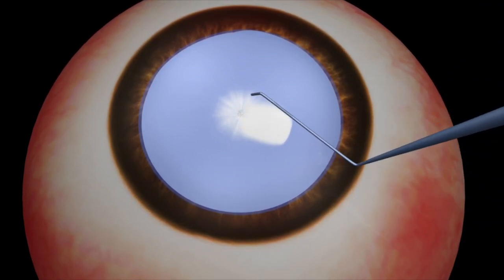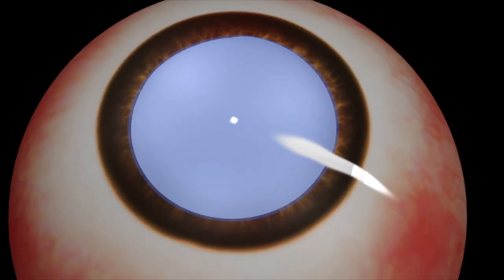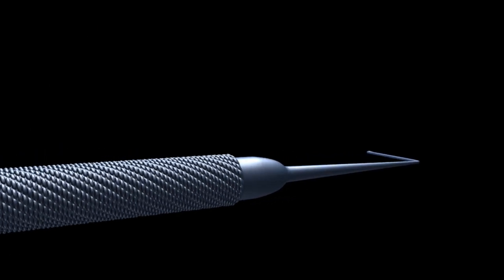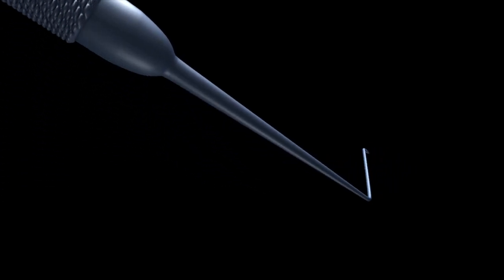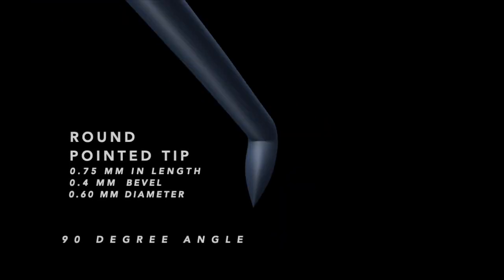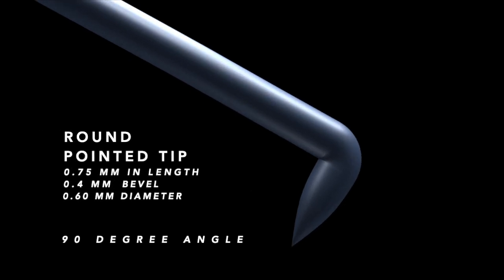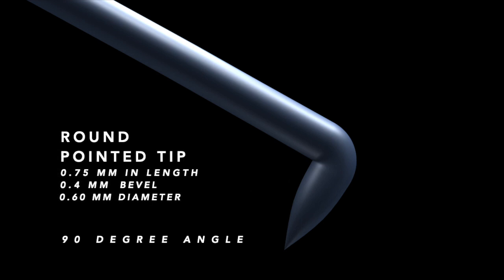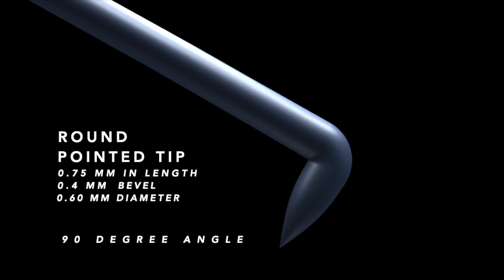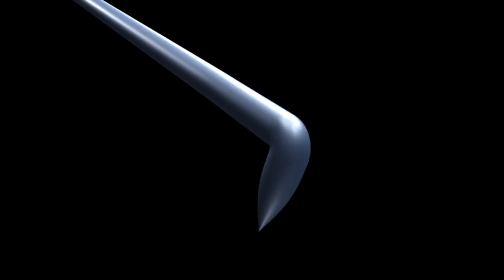Once the decompression is complete, the capsular rhexis is very safely initiated and completed with the forceps without the risk of peripheral extension of the tear. The overall design of the Sewing Needle Microcapsulotome is similar to all types of hooks, consisting of a round knurled handle and a 60-degree angle distal shaft with a tip approximately 0.75 mm in length, 0.4 mm sharp puncturing point, and 0.6 mm in diameter, angled at 90 degrees in relation to the remaining distal portion. The mode of action of the Microcapsulotome is similar to a sewing machine needle system used to sew knit-type fabrics, where the rounded needle tip slips between the yarns rather than cutting them. The round pointed tip of the Microcapsulotome penetrates the capsule and creates a hole without cutting the capsular fibers, preventing pre-evacuation stellate burst as a result of the high intralenticular pressure and preventing capsular tear extension.